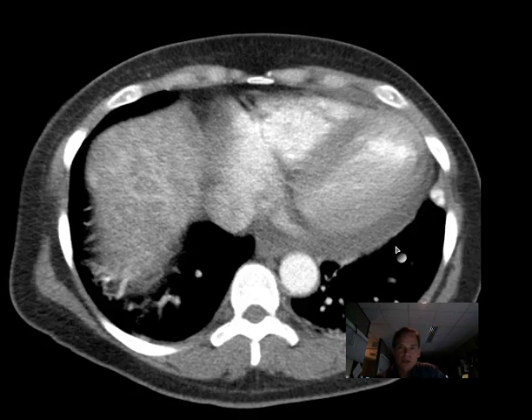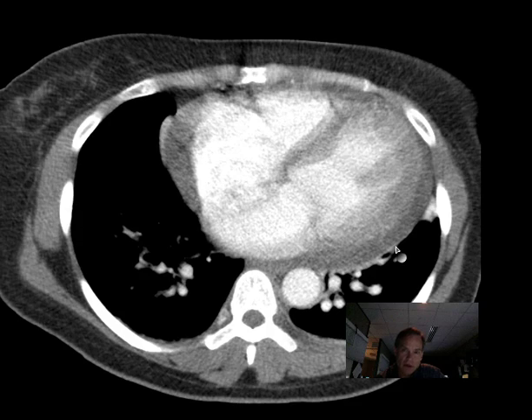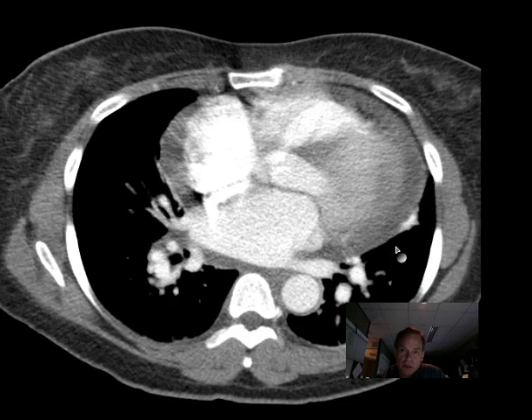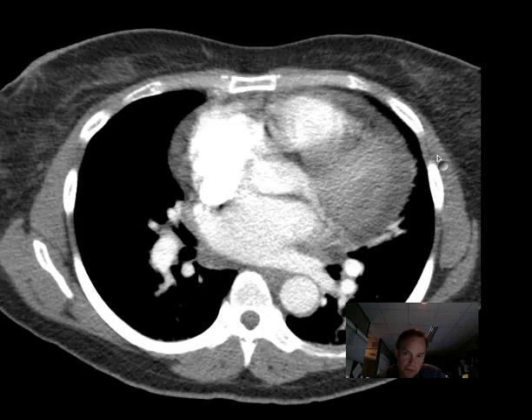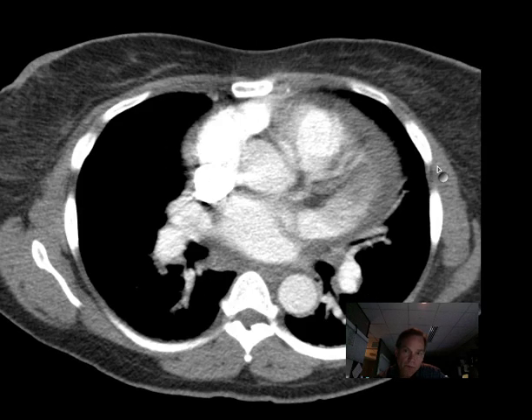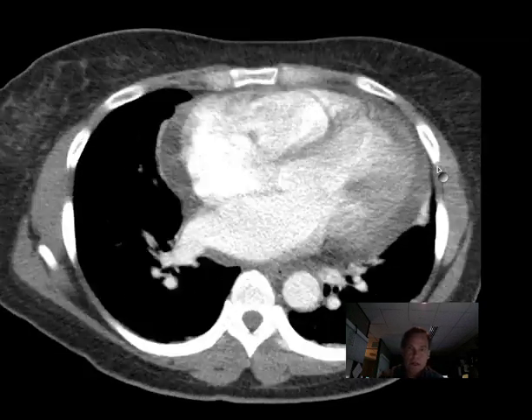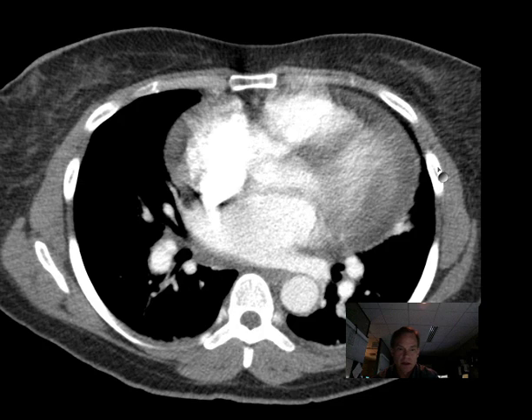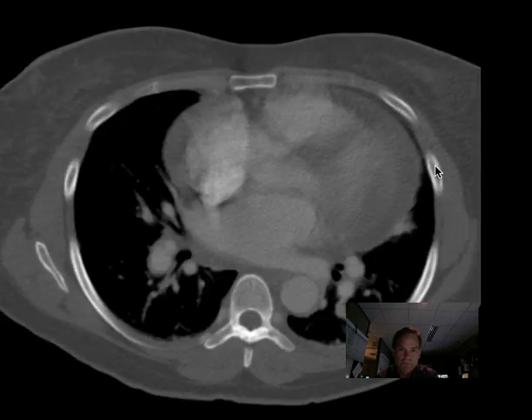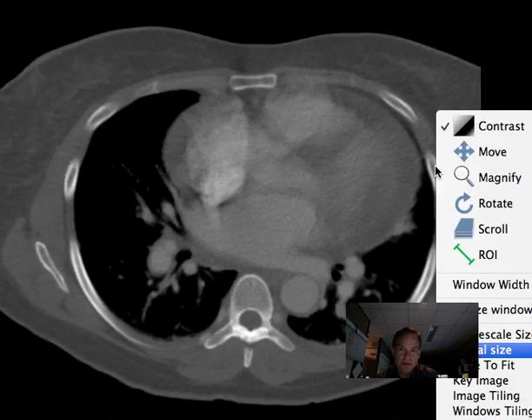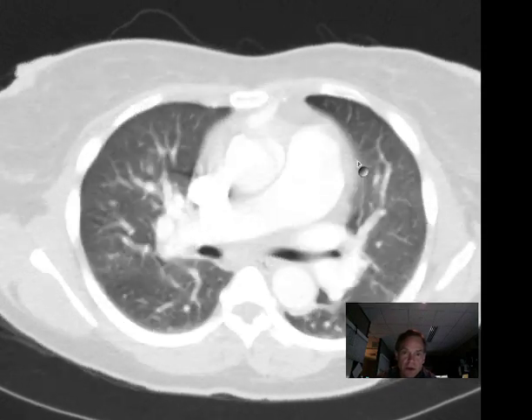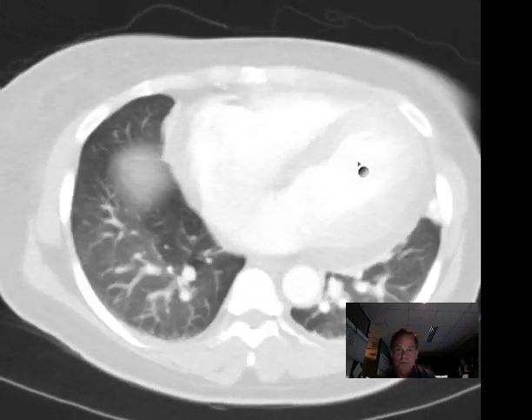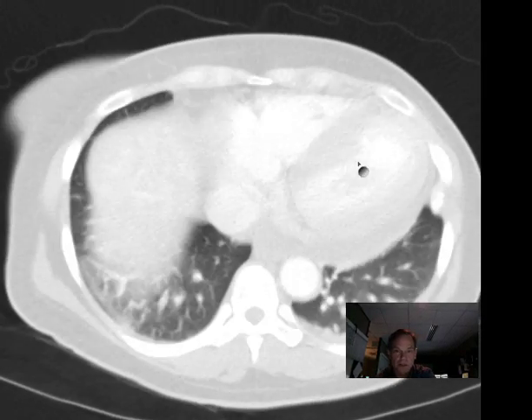So here we have a big heart. Looks like we have some pericardial fluid. And let's see how the lungs look here — pretty clear.